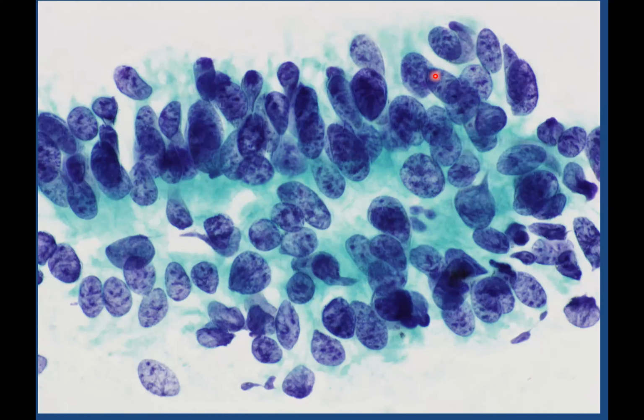Now let's have a look at the arrangement of these cells. They're elongate. They look like they are chaotic columnar cells. But in addition, we seem to have some gland openings here, and then right at the top here it's slightly overexposed, but can you see we've got some sort of fronds of cytoplasm that are rather irregular, and this is where the sample has literally been pulled away from the basement membrane, leaving little tags of cytoplasm.